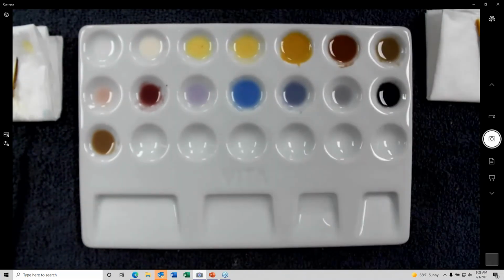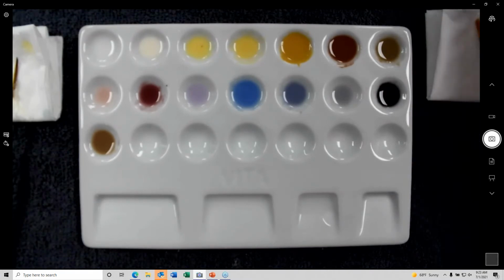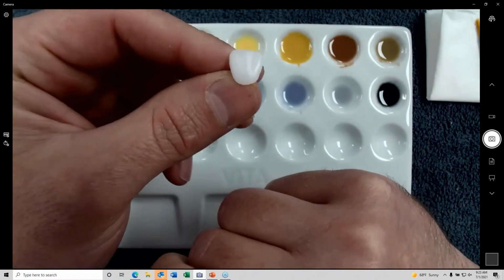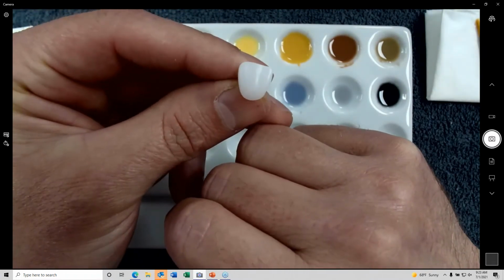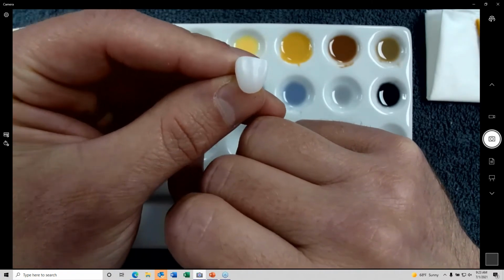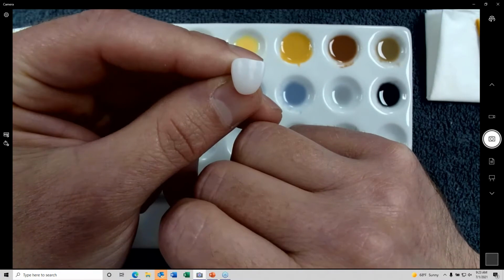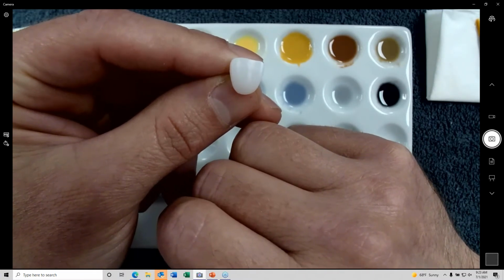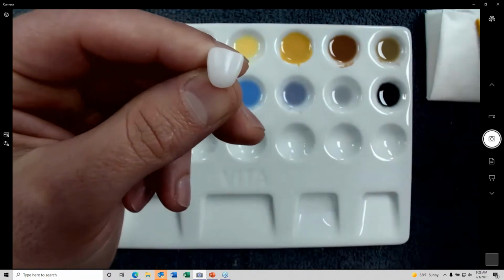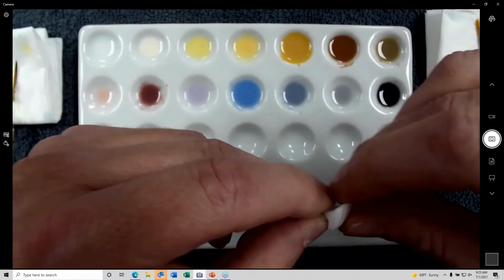And let's talk a little bit about post-sintering. So again, you can do it just white. This would be just a white unstained, and it's pretty tough to characterize a total white crown like this and add enough chroma to really make it look nice. But this is one of the examples I had from some of the samples that I was making.